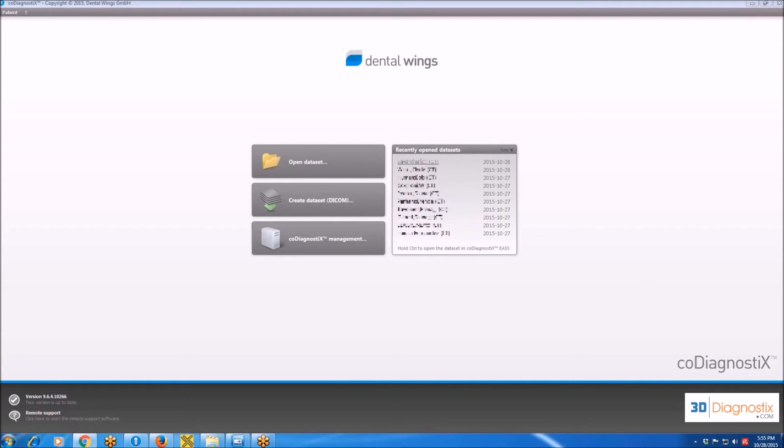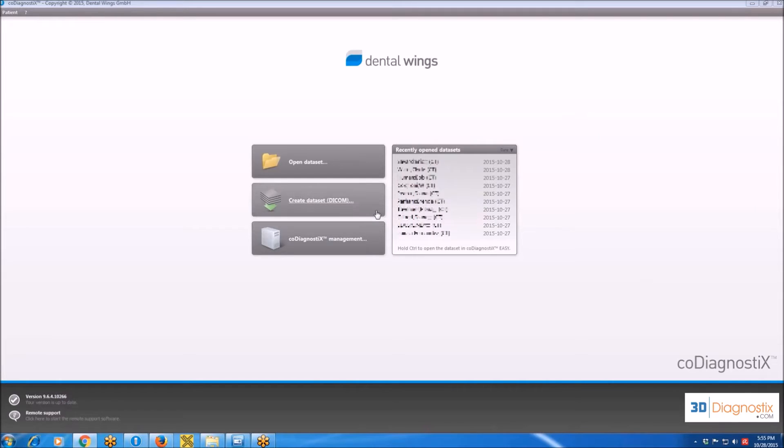A window on the right over here with the datasets that has the names of the patients - that's the recently opened datasets. And on the left, over here, we find three main buttons.